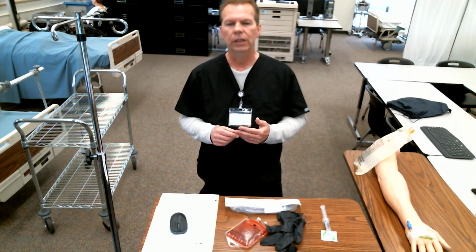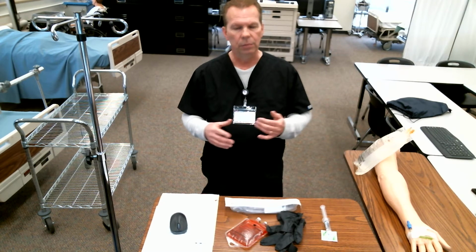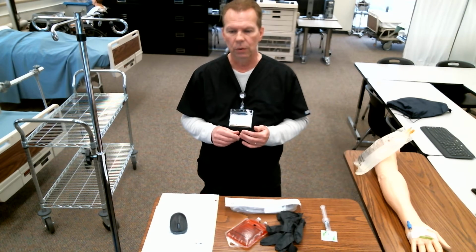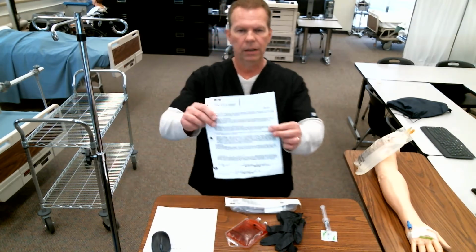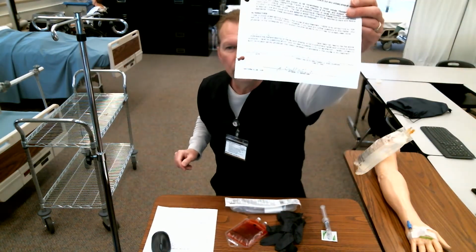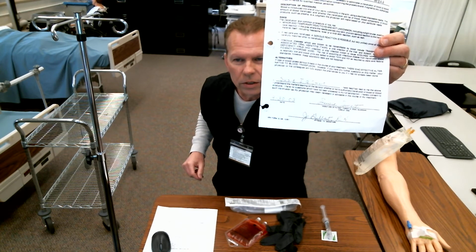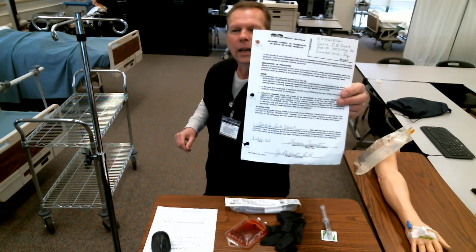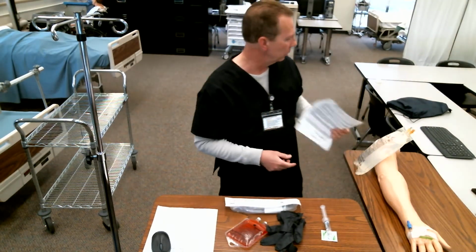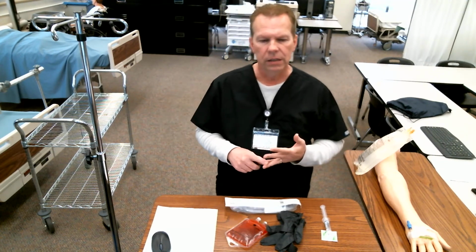You want to make sure that you get a consent form signed. Giving blood has to have consent, so you want to make sure that you do get the consent form signed. And here's my little consent form, if you can see now. Well, yeah, there you go. So our patient is Susie IQ Smart. So Susie has signed our consent form, and that's our consent form with our information there. And so get that consent form signed.